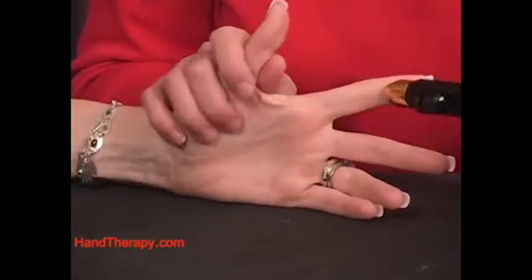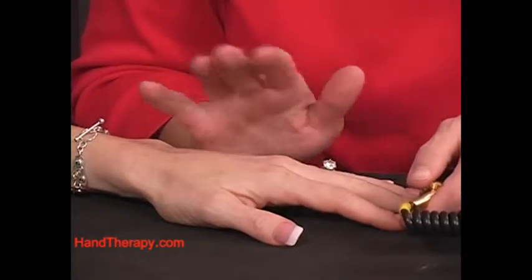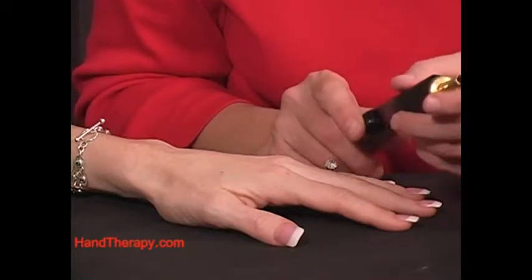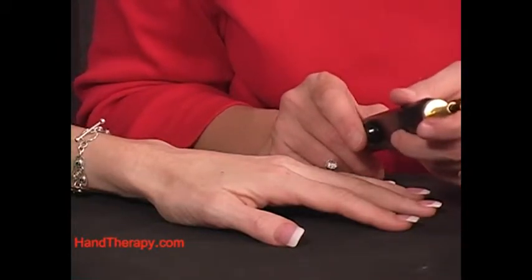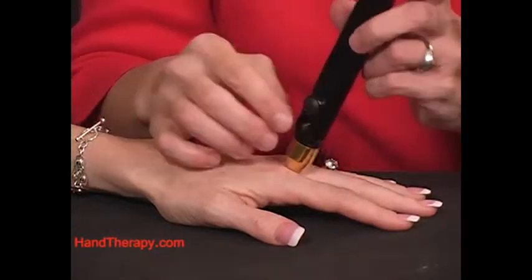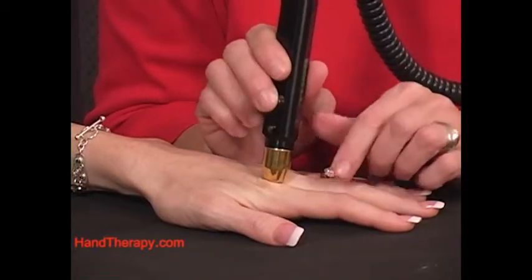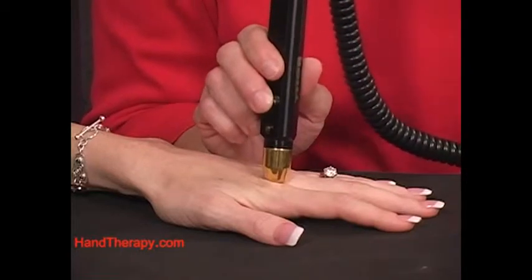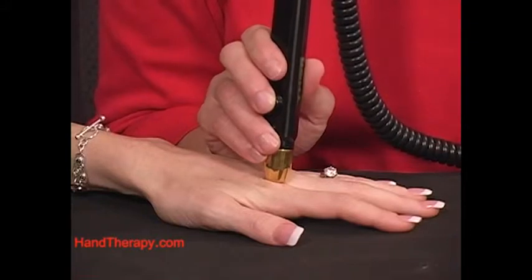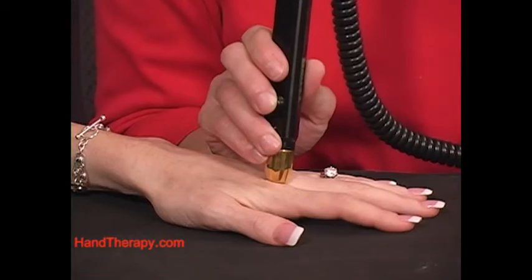And what I'm going to do 3 days a week, I'm sorry, to every day, to 5 days a week. I'm going to use my single probe, and I'm going to do it continuous for 15 to 20 seconds. I want to deliver anywhere from 2 to 4 joules. If I'm going to do 4 joules, then I'm obviously going to do it for 20 seconds. I can do a pulsed frequency too of 2.5 hertz. And like I said, treat it for about 30 seconds. As the condition improves, I'm going to decrease my frequency.